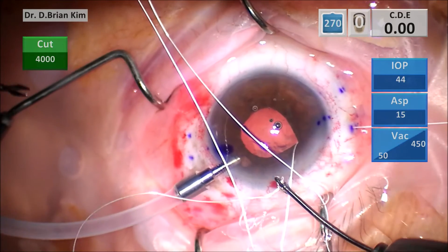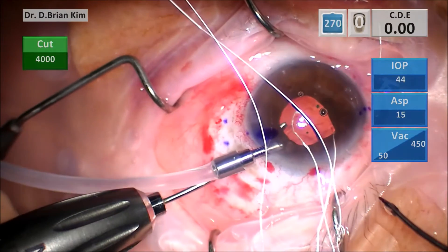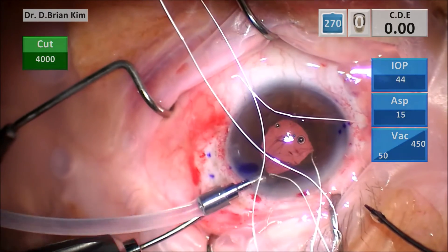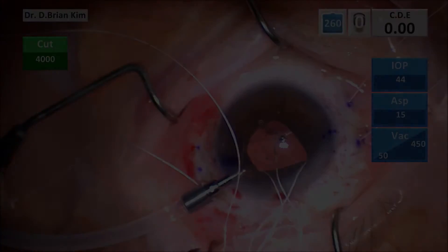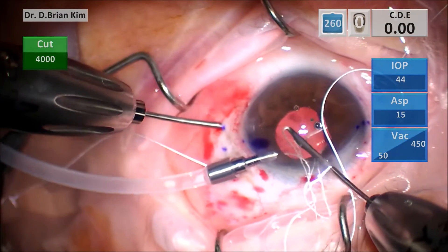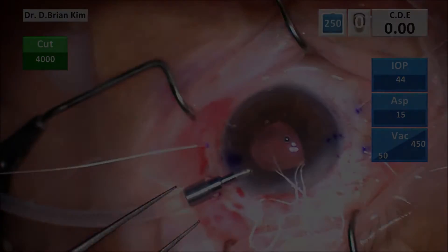When I did the proximal side, that part was no problem. But when I tried to access the sclerotomy, I noticed that my anterior chamber maintainer was in my way. So the lesson here is to make sure I place my anterior chamber maintainer away from any of the manipulation I'll be doing for the surgery. As you can see, I'm feeding the proximal side again here because I got my sutures turned around. The other learning point for me was to start with the distal sutures first, place them through the sclerotomies, and then the proximal sutures last — otherwise you might get them mixed up and the sutures might have a little loop in between them.